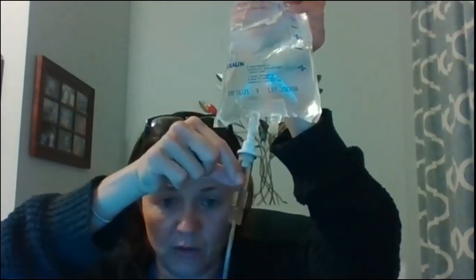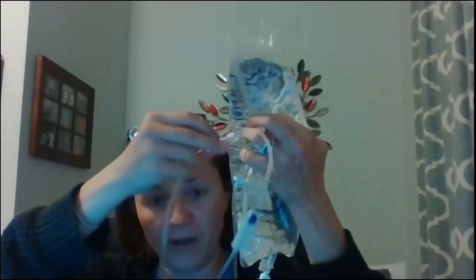So your primary IV line set is going to be where your primary line is hanging. Those primary IV line sets are going to have your drip chamber, an anti-reflux valve. It's going to have a port here at the top to attach your secondary to. And as we go on down, and I'm going to go over this again later, it's going to have some sort of a device. The tubing that you're going to be using is going to be put onto a pump.